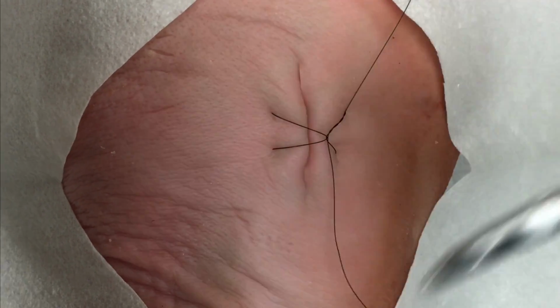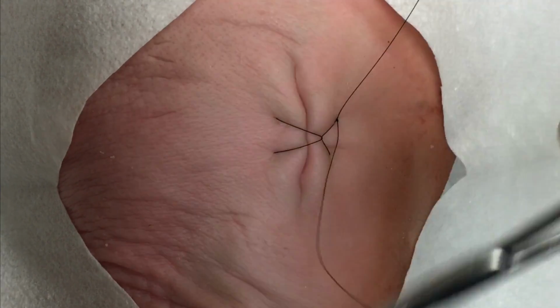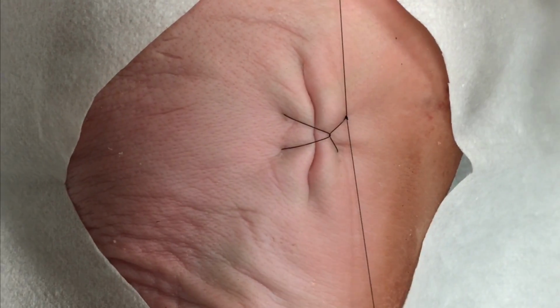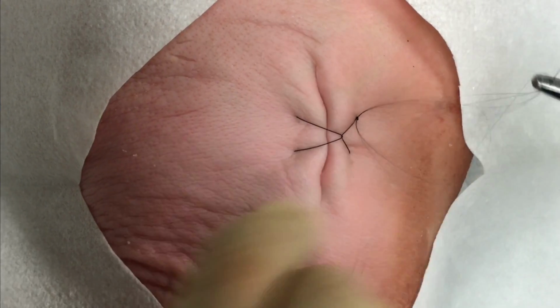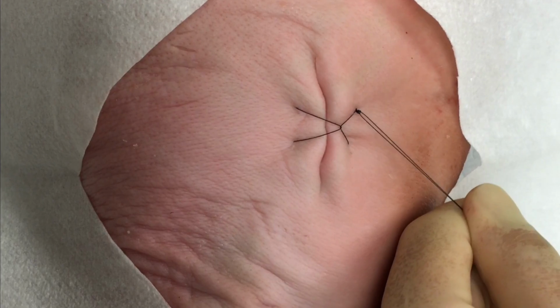This will also achieve that same locking effect, which allows for great wound edge eversion, but also prevents the splaying that can sometimes occur with placement of a traditional horizontal mattress suture in the center of the wound.